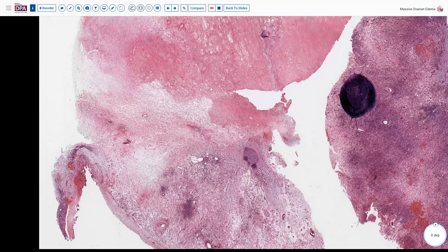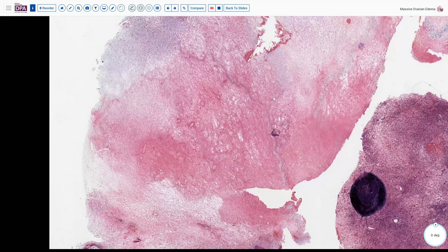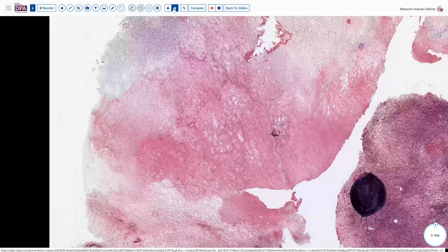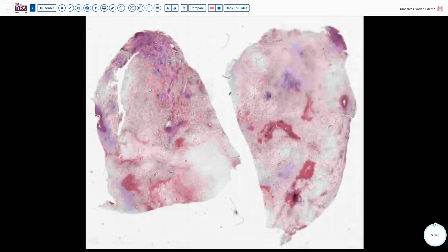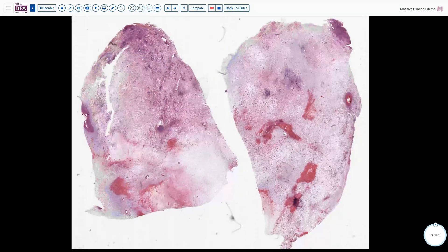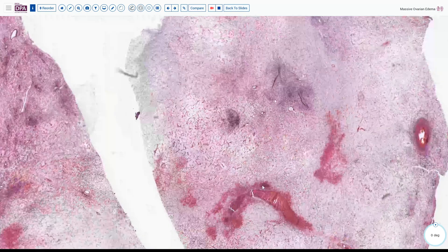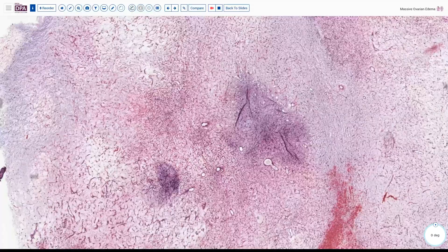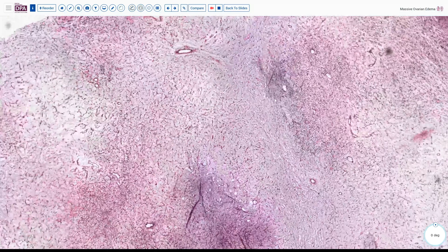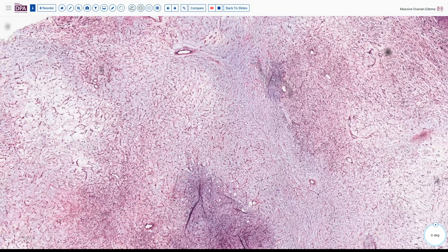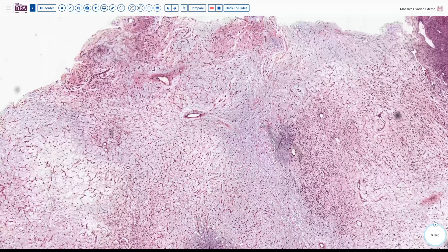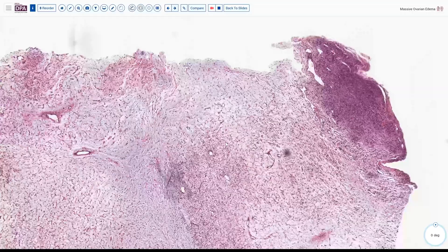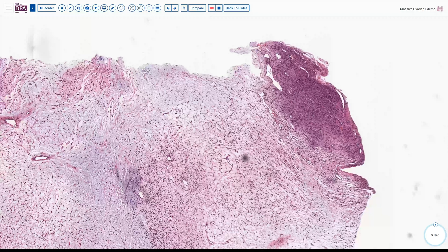The necrosis reminds us that in some instances this entity has been associated with a degree of partial torsion. Here's another section showing this very massive pattern of edematous fluid separating the stromal cells, condensing a little bit around the vessels, and sparing the cortical zones to some degree.